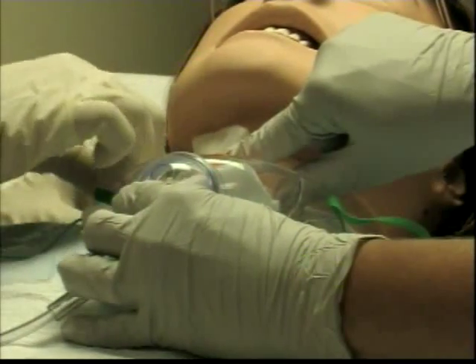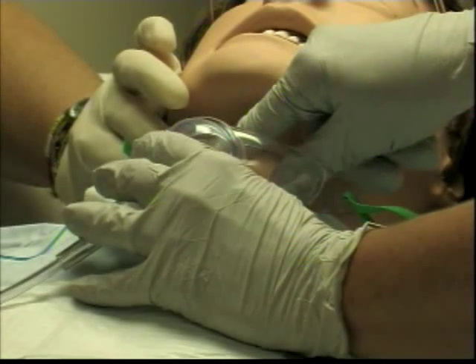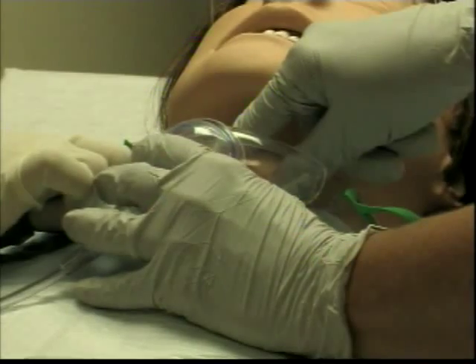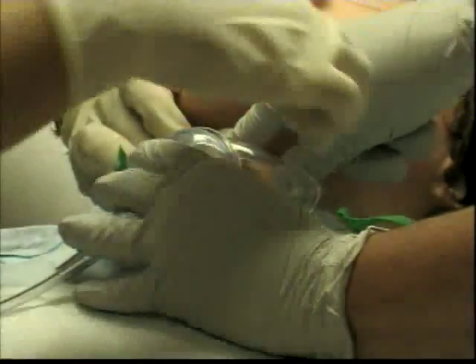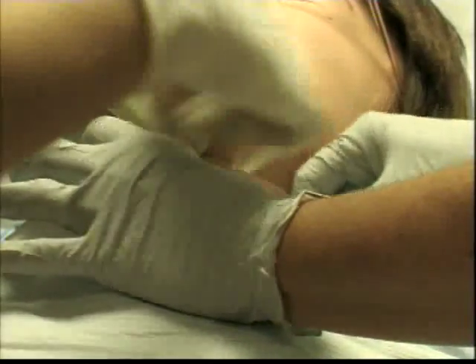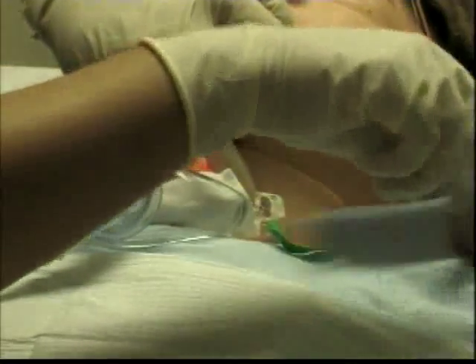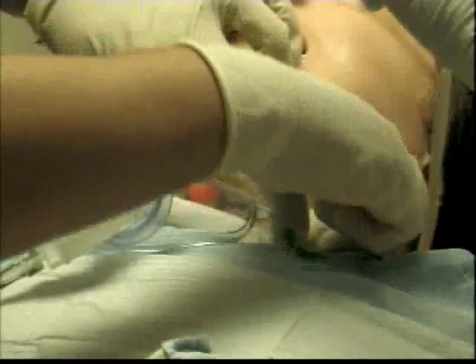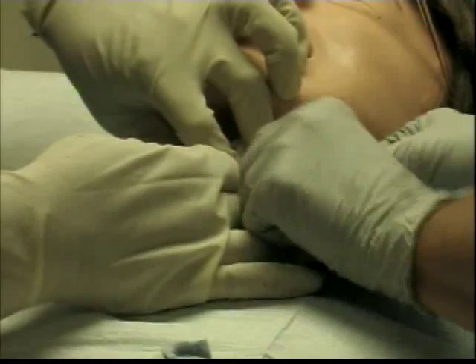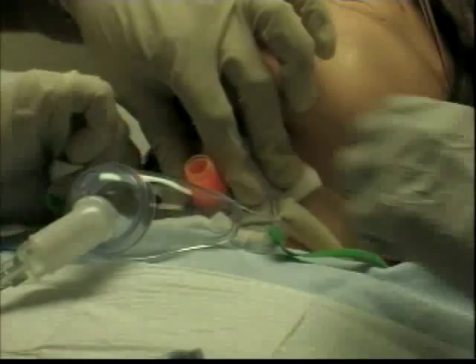Now this is going to be especially challenging if the patient has a fresh trach and it has sutures in place, so you want to make sure that you are very aware where the sutures are and that you're not putting pressure on them. Okay, I have this one right here. I can hold this in here, and I can remove the second strap, and she can remove that one from that side since I can't quite see it. And then I will put the other side of the gauze in place, and then she will thread it through, and we'll put it in place.